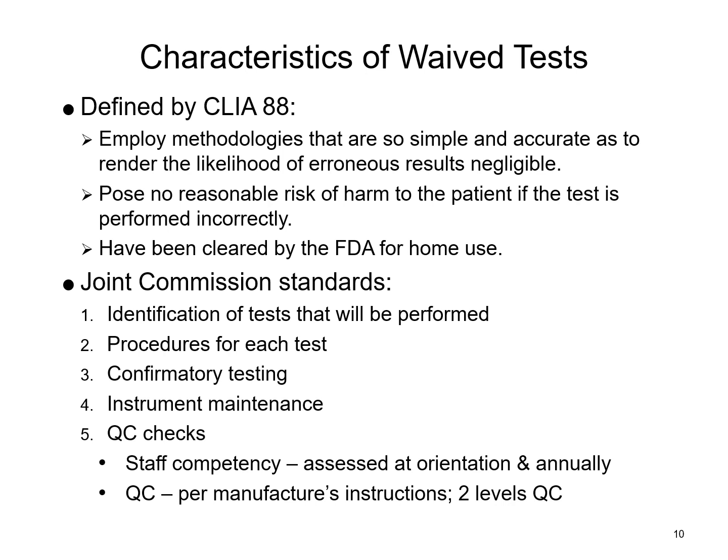If there's ever any kind of inspection, they know when they come in that they should expect to see this batch of tests being run in your facility. If you're running something else or you're not running that, then there's going to be issues. You do have to have a way of confirming the test, especially if the procedure says to confirm any positive or negative reaction. You need a way to confirm results, whether you do it in-house or it's a send-out. You also have to list any instrument maintenance that's required, as well as QC checks that are done.